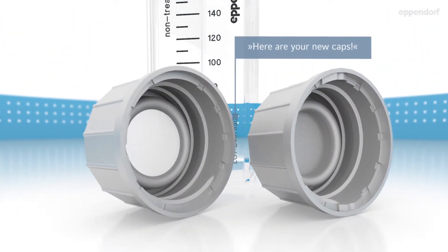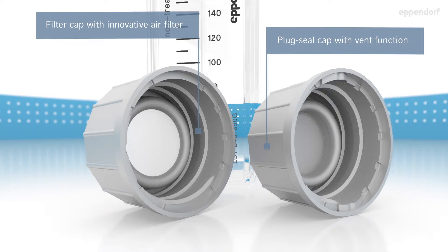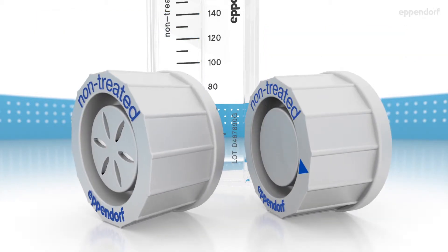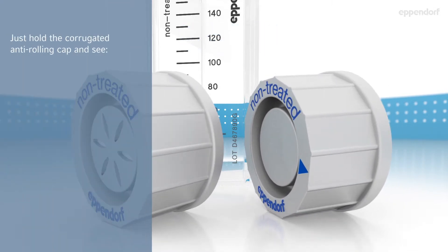Here are your new caps: plug seal cap with vent function, and filter cap with innovative air filter. Anti-rolling design — just hold the corrugated anti-rolling cap and see easier opening and closing. Easy and ergonomic operation.